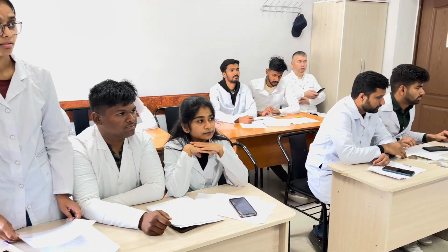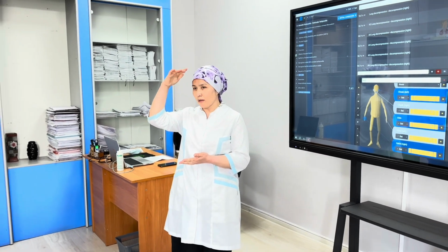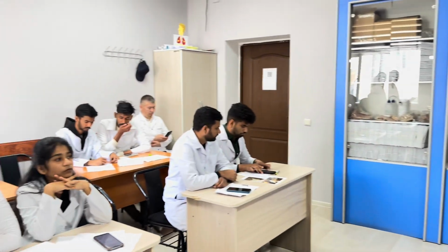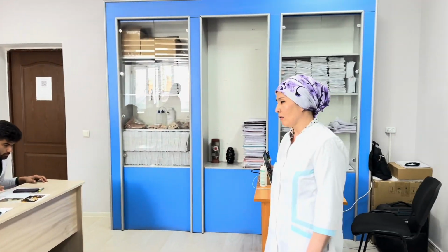Yes. So here we can conclude that sinus tachycardia means the heartbeat is more than 100, and we can see very rapid rhythm on the ECG, but all the waves are here: P wave, QRS complexes. Also, regular rhythm is here. Yes, it's sinus tachycardia. Okay, yes, thank you, good.